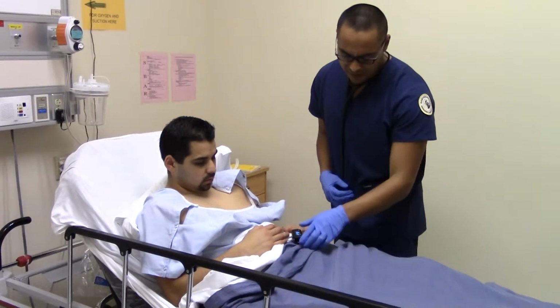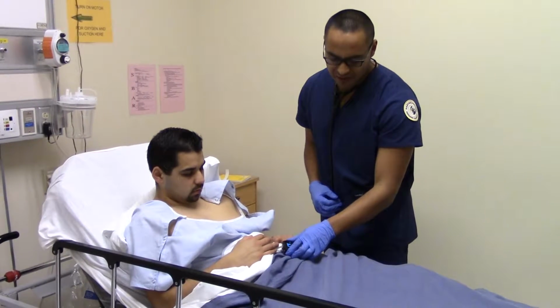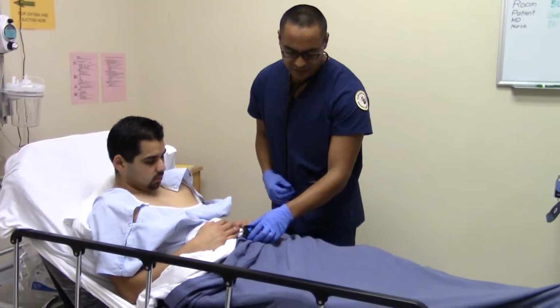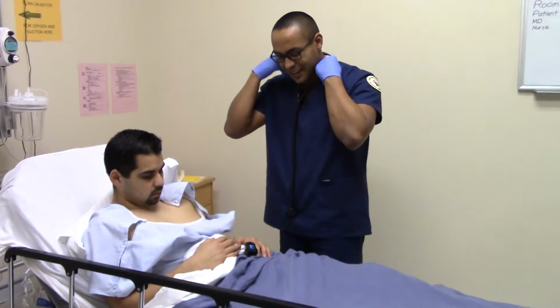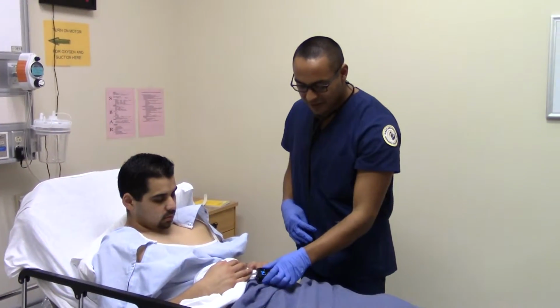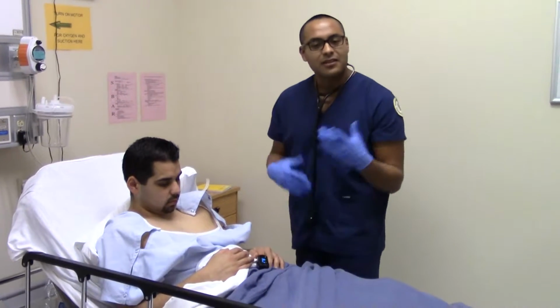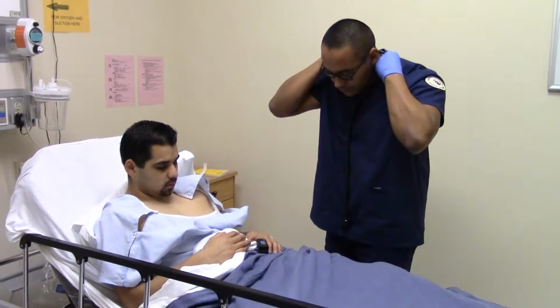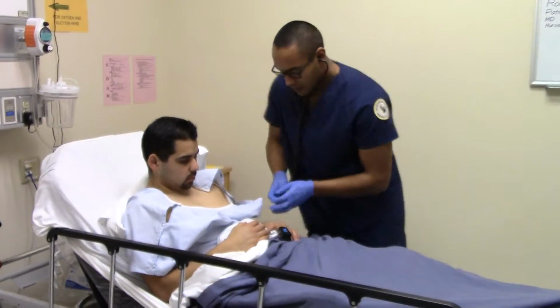I'm going to talk to the camera what I think in my head. It was at 55, 56, 58. Now it's at 60. A little low. He already said he couldn't breathe that well, but it's staying at that point. That was my inside thoughts. That saturation looks pretty good though.